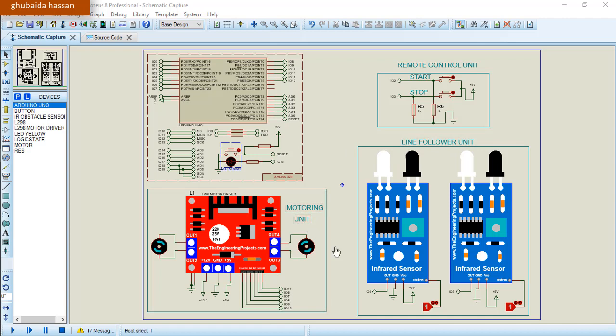So the wheelchair will consist of two motors, and the two motors will be driven using the L298 motor driver. So in the line follow unit, we will have two IR modules.